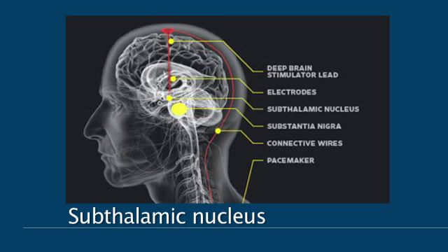In deep brain stimulation, there are a number of targets that we can select. The way that we choose those targets can sometimes be a little bit subjective. It can be based on our own experience and our own skills, but it can also be based on the patient's specific symptoms and other factors.